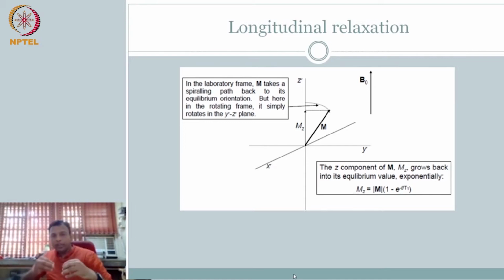So different locations, depending on the volume that we started with, which had the signal, had proton density. So the signal that you are getting, one is the characteristic of the material with respect to having the proton density that is dictating your value of M. Now, in addition to that, we have talked about the decay, the relaxation time itself is a characteristic of the sample material.